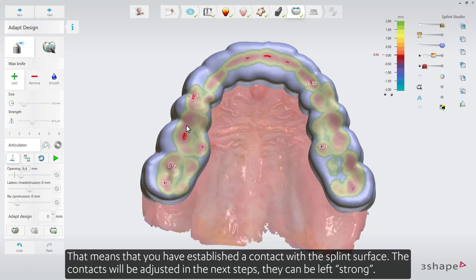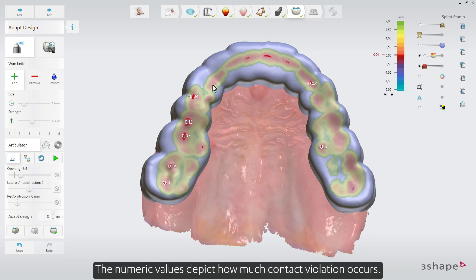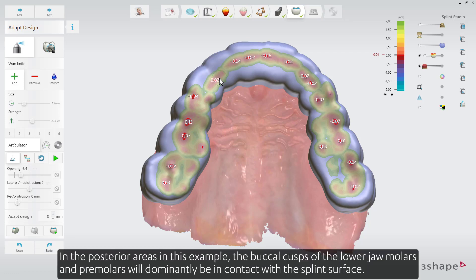The contacts will be adjusted in the next steps — they can be left strong. The numeric values depict how much contact violation occurs. In the posterior areas, in this example, the buccal cusps of the lower jaw molars and premolars will dominantly be in contact with the splint surface.